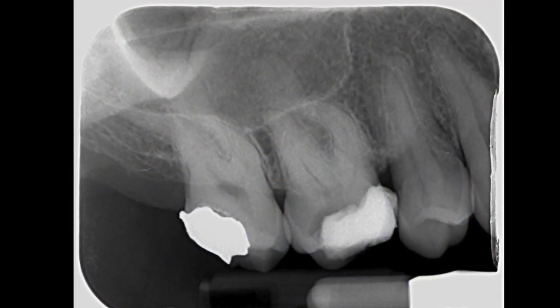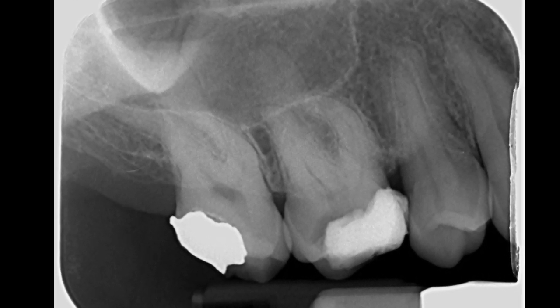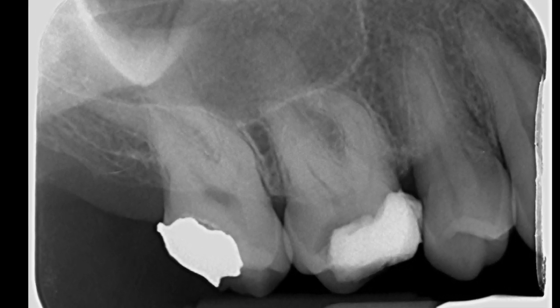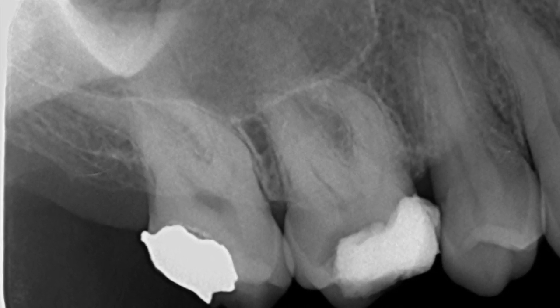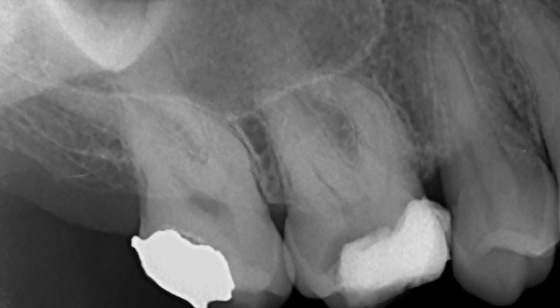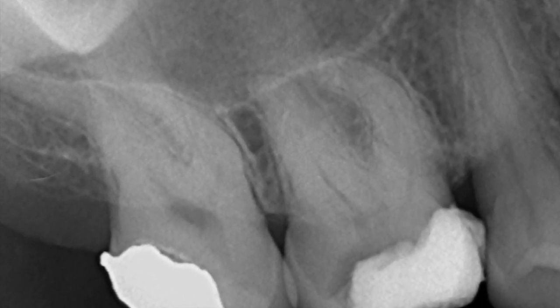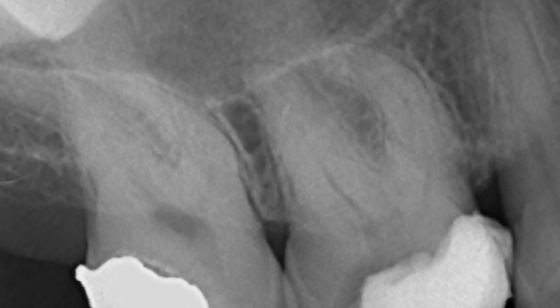We're going to root fill the maxillary right first molar. The tooth was referred in because the general practitioner couldn't locate the root canals. The tooth looks fairly innocuous on the radiograph; however, the mesial buccal canal does appear to be moderately curved. As you'll see, we're in for a real treat with this one, because not only are the canals a lot more curved in the buccal-palatal direction, but there are actually three mesial buccal canals.